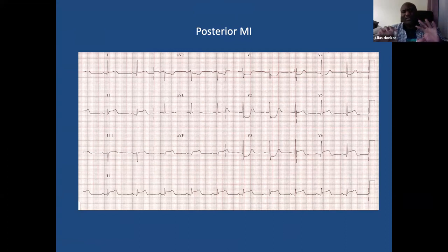And what a lot of cardiologists do, because it's a posterior MI, is a posterior ECG recording, like we spoke about, in the same horizontal plane as your V4, V5, V6, you have V9, V8. I should really have a picture here, shouldn't I? Sorry. Basically, you can do V7, V8, V9, in the same horizontal plane as V4, V5, V6, where your scapula, your shoulder blade, is, and put the electrodes there.